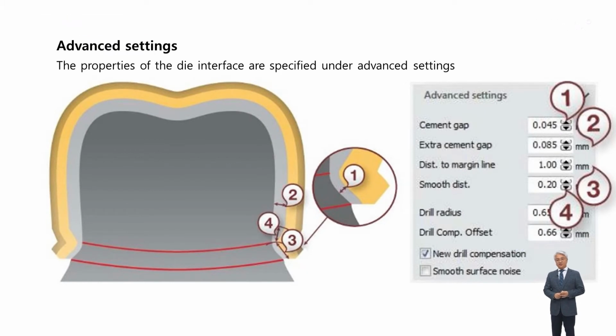In prosthodontics, in the past, a lot of people had their doubts. They doubted whether the crown fabricated via CAD-CAM would fit well, whether it would have good sealing, and whether it would have good precision. A lot of questions were raised on that point. But these questions are no longer raised these days. Zirconia crowns and other crowns fabricated with CAD-CAM: many people now acknowledge the precision and accuracy of these prostheses.